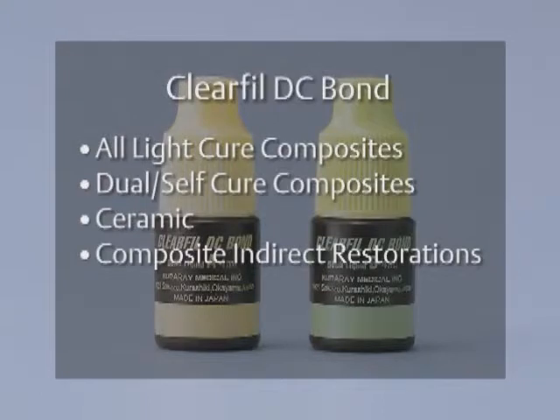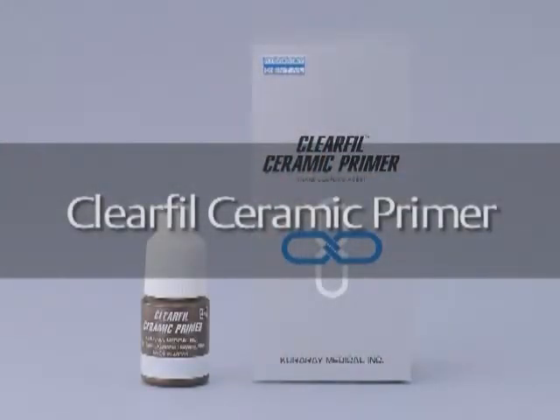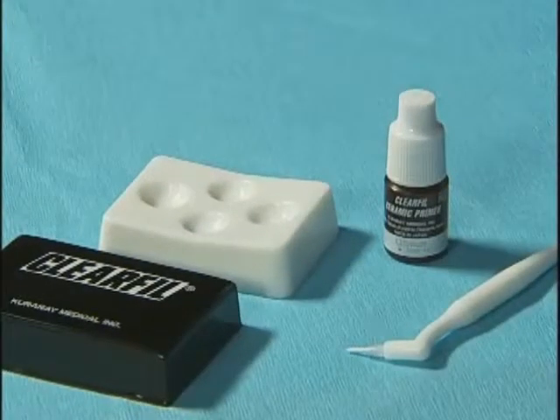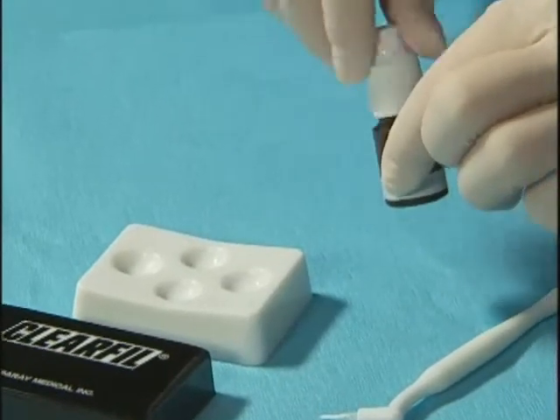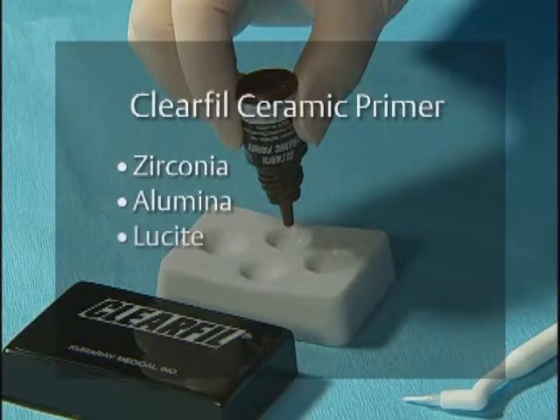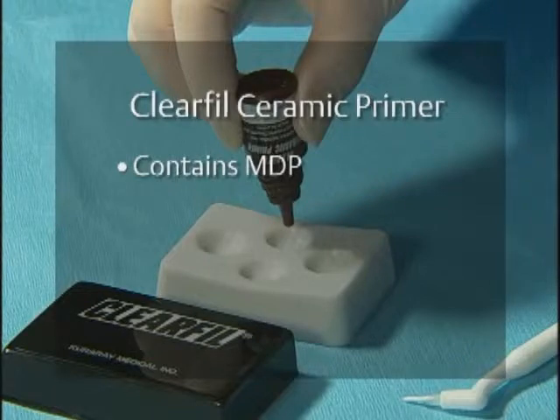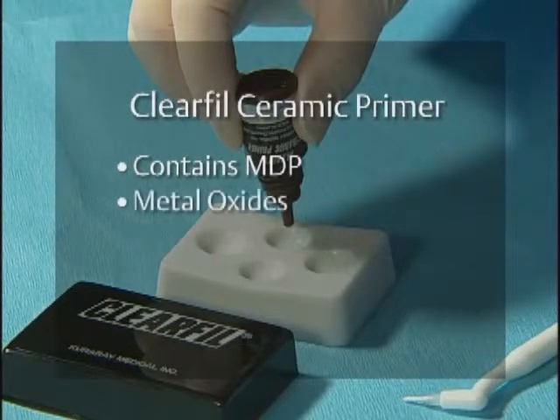Clear Fill DC Bond's dual and self-cure resins assure reliable bonding for core build-ups and indirect restorations. The thin film thickness makes it ideal for use in cementation of indirect restorations. Clear Fill Ceramic Primer is a single-component adhesive primer used to enhance the bond strength between resin-based materials and any type of ceramic restoration, including zirconia, alumina, lucite, lithium silicate, and composites. It contains the universal adhesive monomer MDP, found in Panavia, which bonds very strongly to metal oxides.